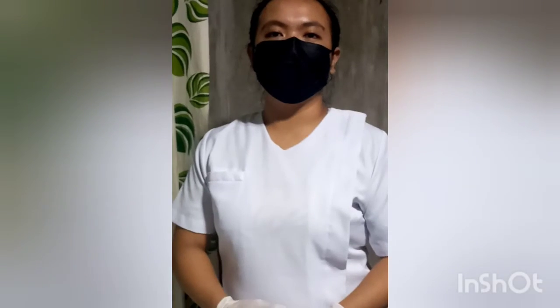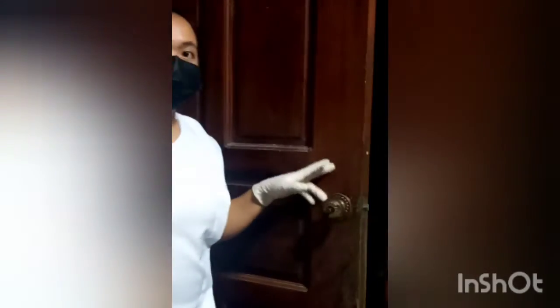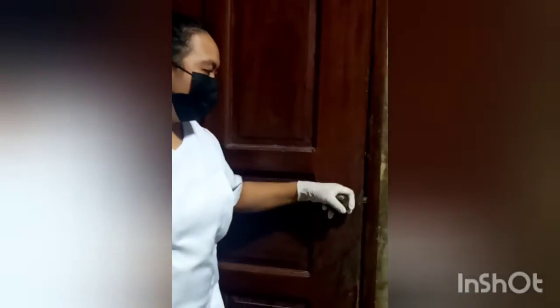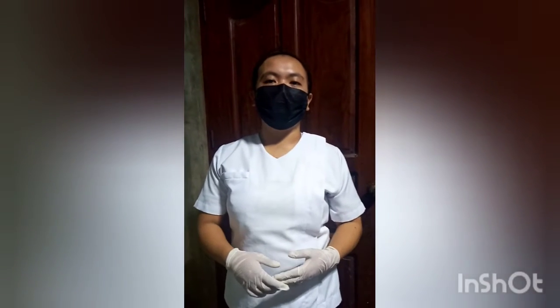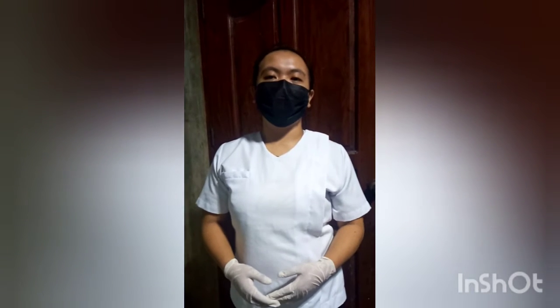After identifying the patient, close the curtain around the bed. And we need to close the door to the room if possible. As you set up the machine to record a 12-lead ECG, explain the procedure to the patient.